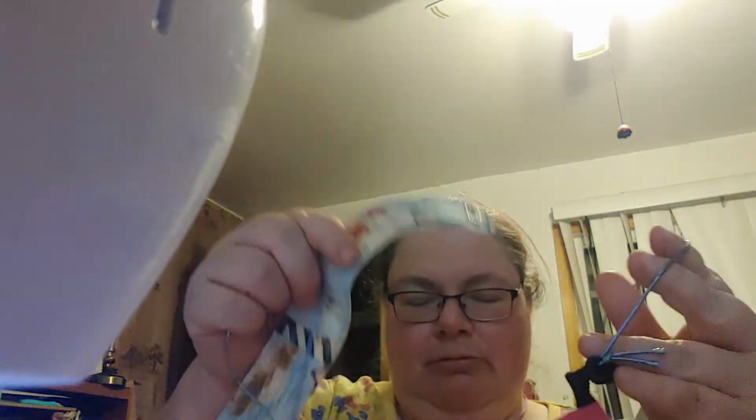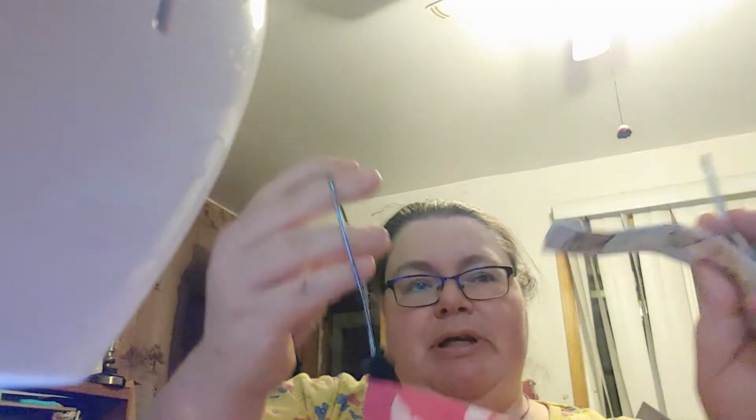So for the ones with single snaps, again, you can do it at the back of your head. It's easier if you do it holding out while you don't have your mask on. So you just thread your head saver through the elastic, 1 elastic, 2 elastic, snap it together, comes up, put your mask on, voila.